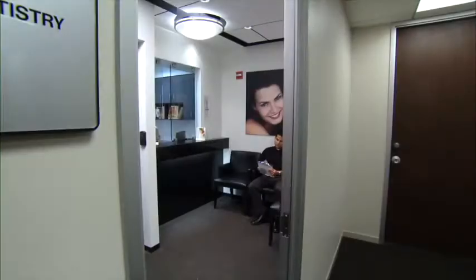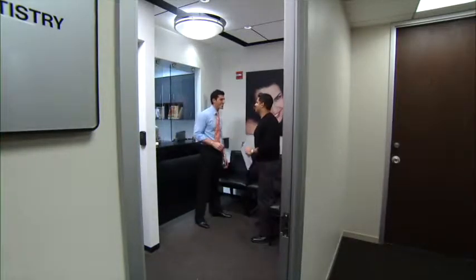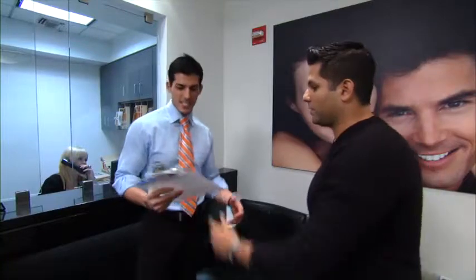Section 3, Candidate Qualification and Patient Expectations. Now you're ready to begin the Zoom whitening treatment. First, you need to determine if your patient is a candidate for the procedure. A consultation is recommended to ensure that there are no underlying oral health issues.